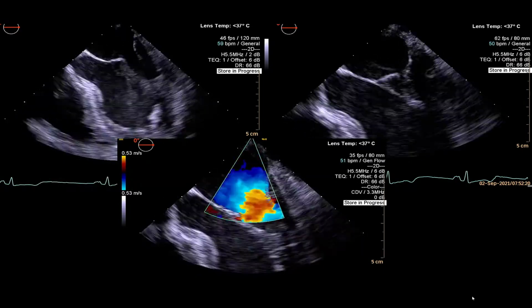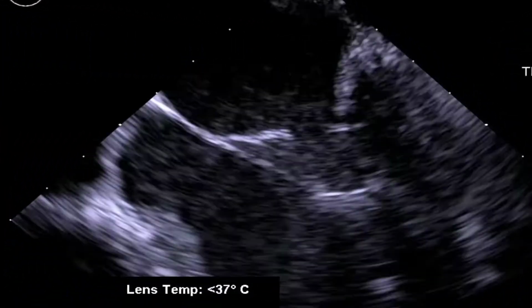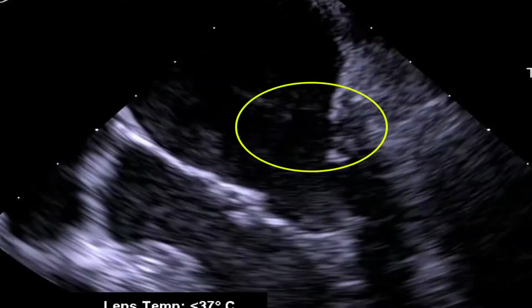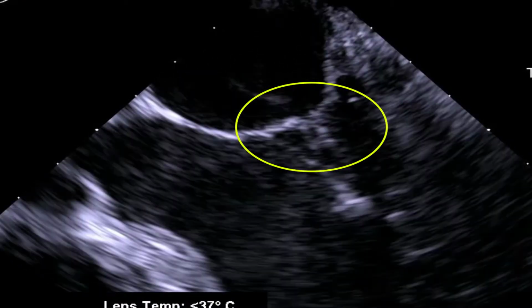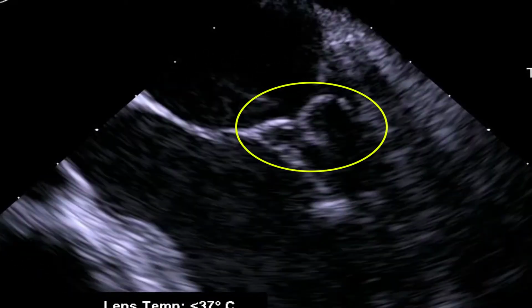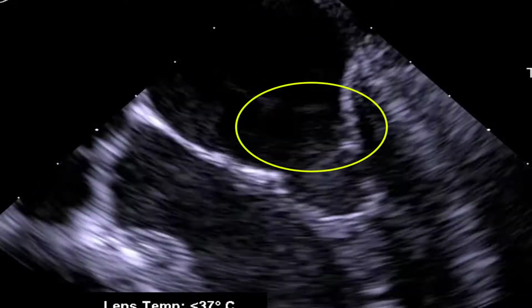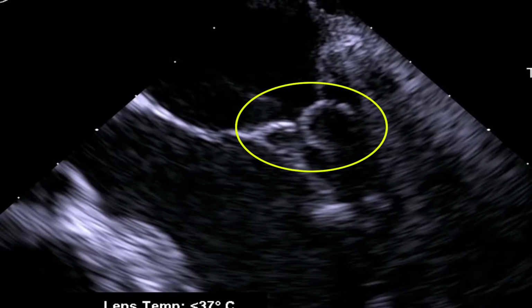Also, if you see that the posterior leaflet is significantly retracted and curled over, this means that a smaller clip may not be able to get under it physically, and you may have to bunch it up with a larger clip. So there was a little challenge in its anatomy as we look at it. Do you agree with that? Yeah, it's very retracted there, so I can definitely see problems with the shorter clip grasping that leaflet, which again, being able to individually grasp the leaflets might be of benefit with the newer devices. Okay.